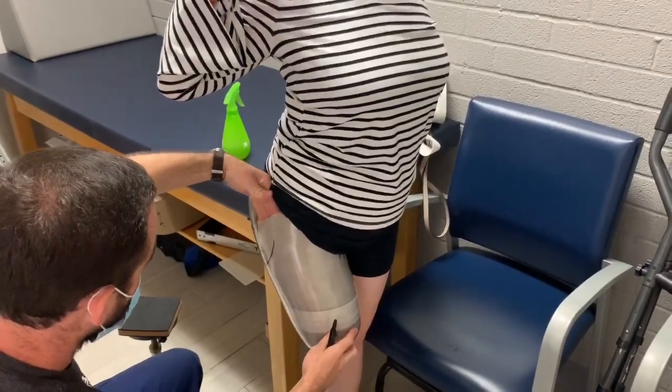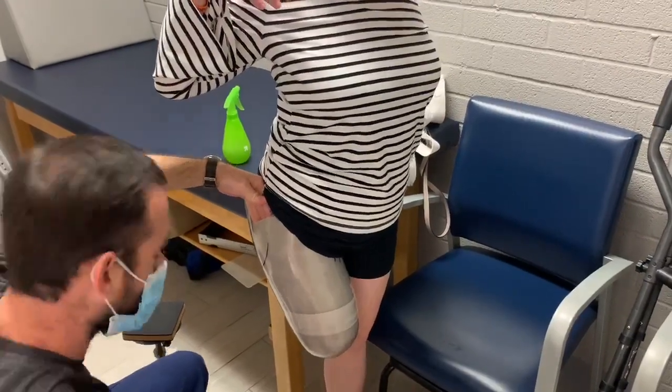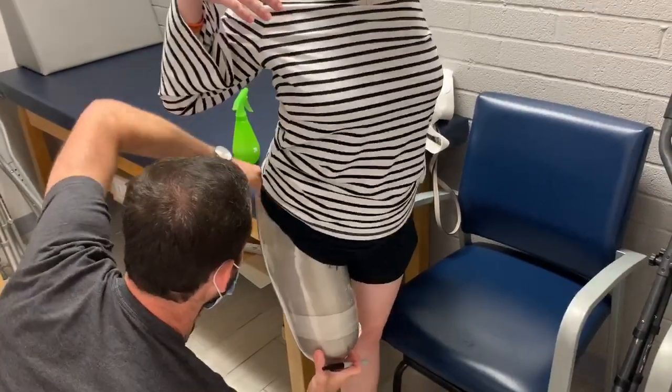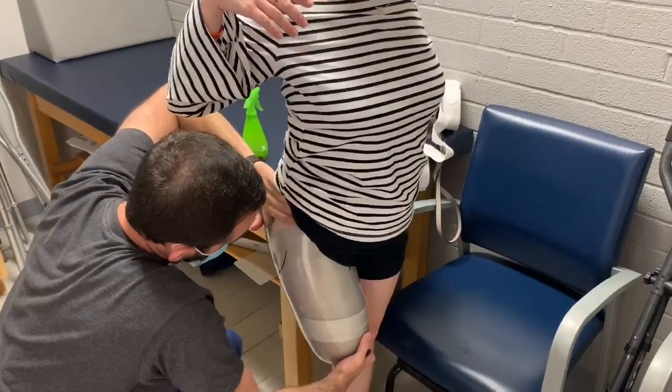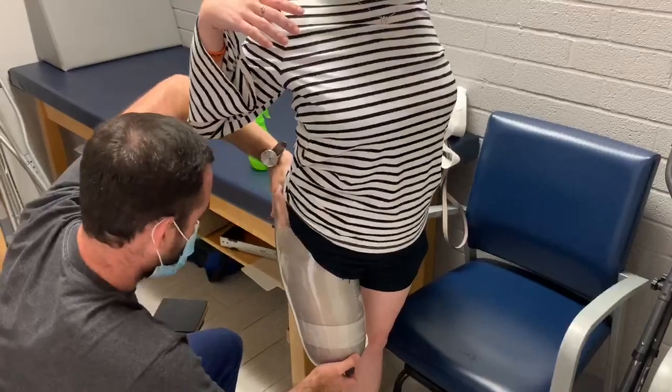This is going to be kind of silly. Try to, like if you were putting a cigarette butt out with this leg. You know how you kind of twist. Yeah. Trying to get that foot to pop out. One more time. There we go. Got it.